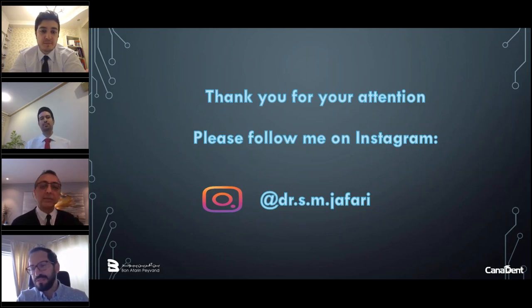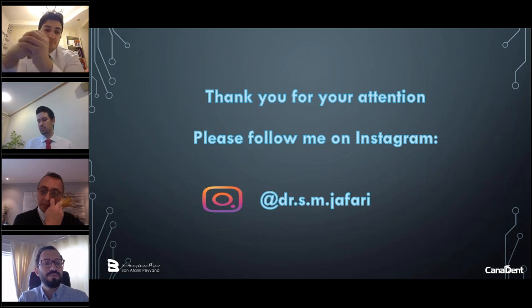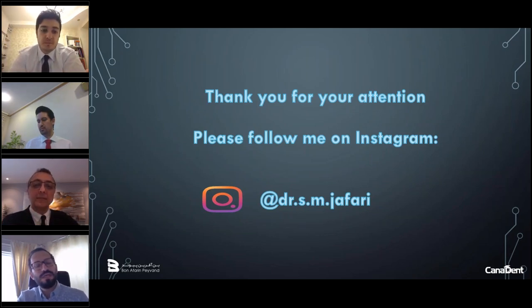I just have one comment regarding the drilling speeds that were mentioned during the lecture. As Dr. Jaffari said, there are different numbers in different textbooks. But I believe the best way is to follow the instructions of the manufacturer for the implant system you use. For example, the Straumann system recommends 1200 for the initial RPM. Some other systems have different numbers.